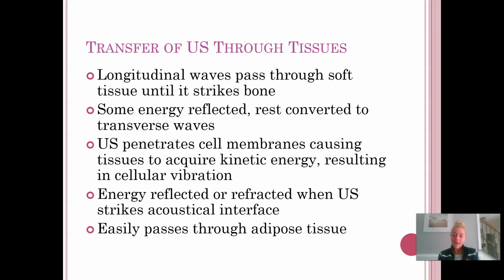Ultrasound will actually pass through adipose relatively easily. So before, when we talked about hot packs and cold packs, we mentioned that if a person has a lot of adipose, it might be difficult to get down to the muscular layer, which is what we're typically trying to treat. With ultrasound, because ultrasound travels very easily through water, and adipose is made up largely of water, ultrasound will travel very easily through adipose. So adipose does not serve as the same kind of insulator with ultrasound as it would with hot and cold packs. So sometimes with our patients who have a lot of adipose, ultrasound might actually be a more beneficial treatment for them.